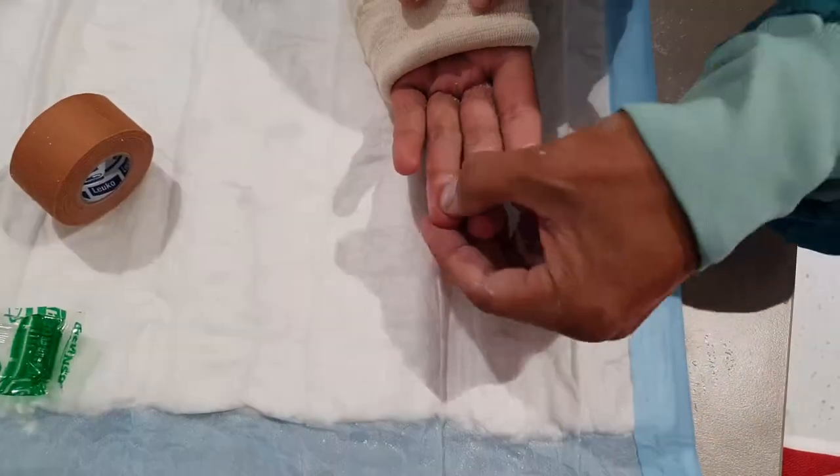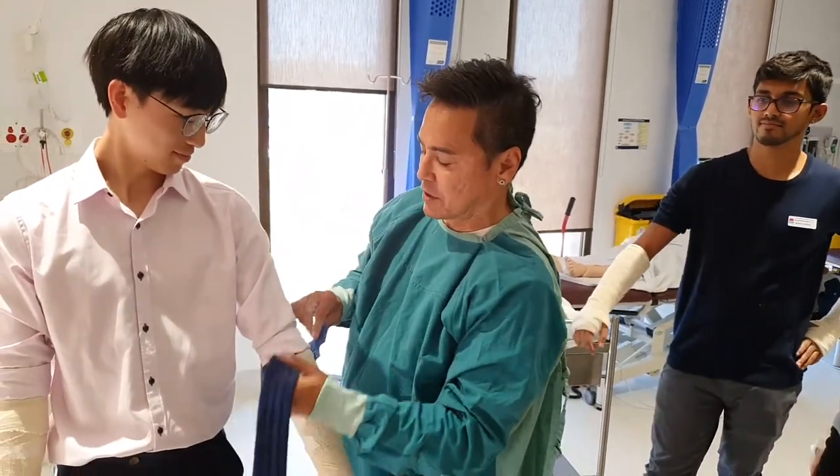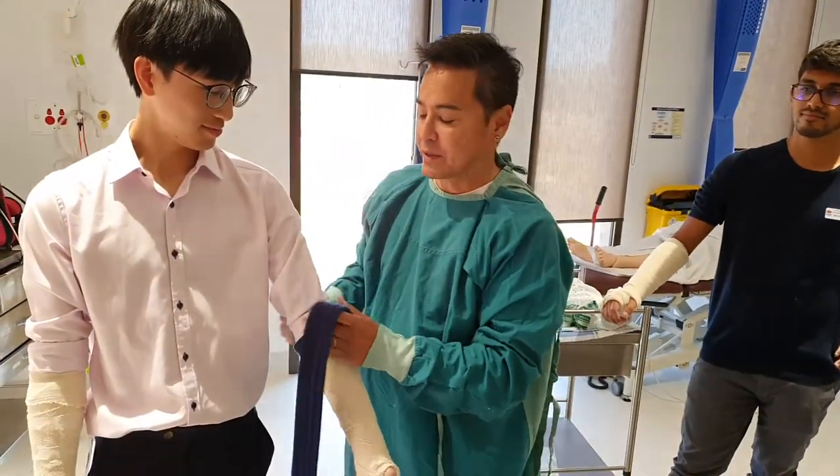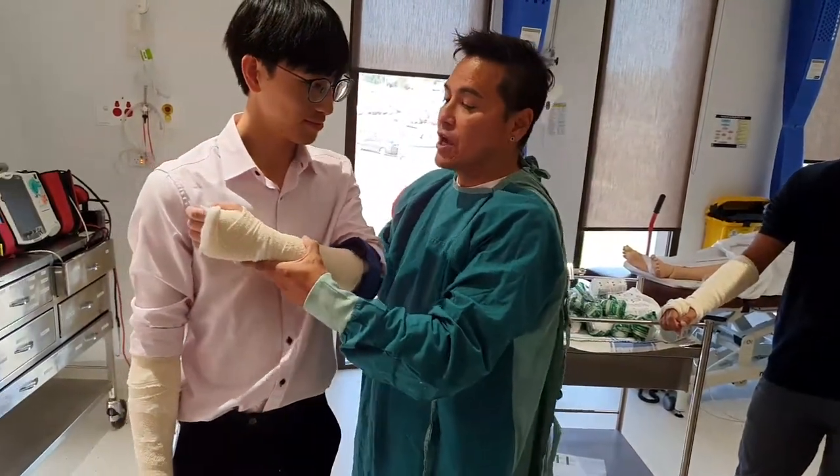Circulation observations — it's nice and brisk. After plastering, I just wanted to go over how to put one of these slings on. I think the principles apply also with a triangular bandage — the idea is that we want the arm to be up here.